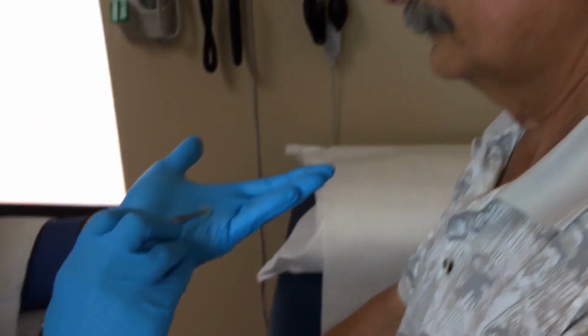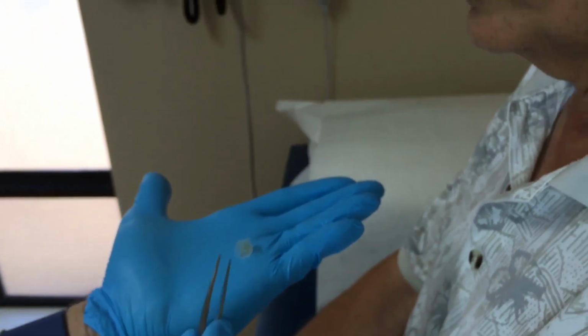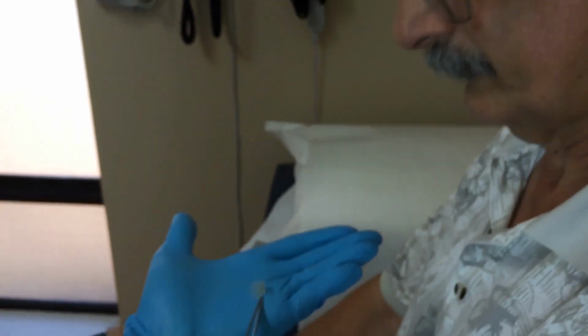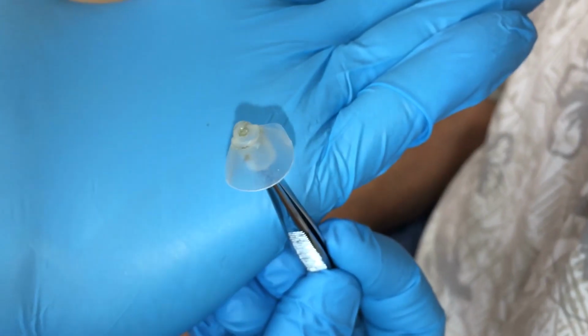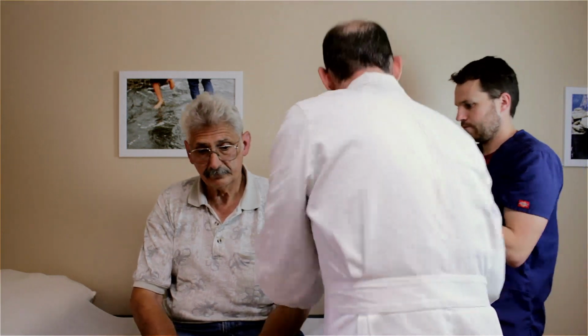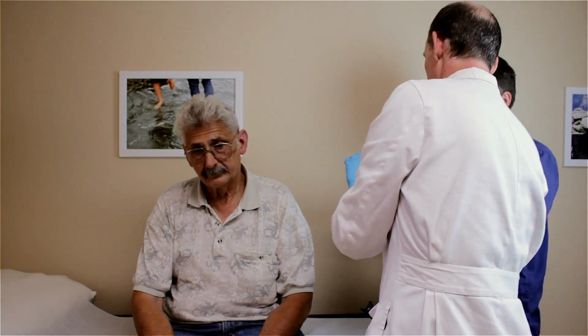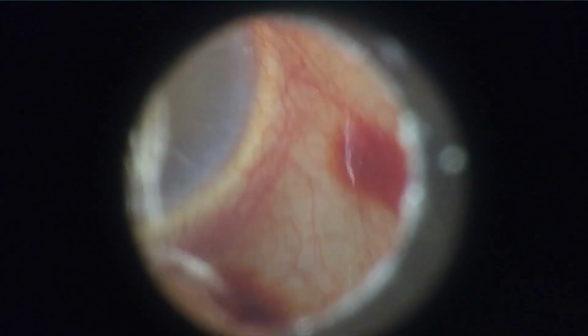So it should look something like that. Yes, that's it. As far as you're concerned, that's intact and complete. All right, let's look at it. Well, we're not done till we take a look at your eardrum behind where that was. The canal was deep enough to make a couple of little bruises or ecchymoses or abrasions on the side of the canal, but it wasn't touching the eardrum. It was pretty close to it, so I'd guess it was fairly uncomfortable.